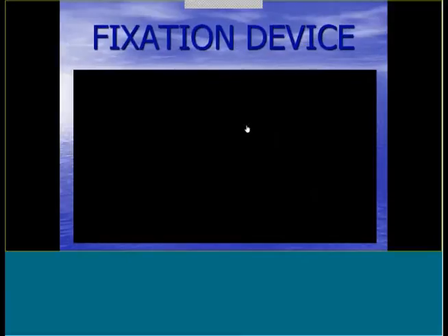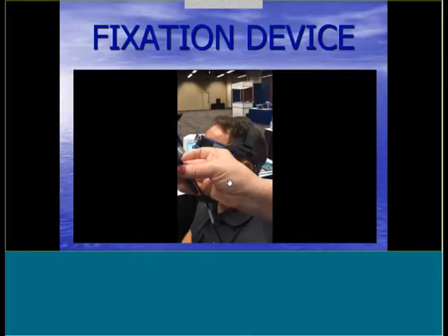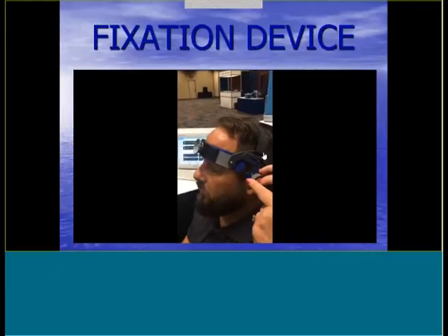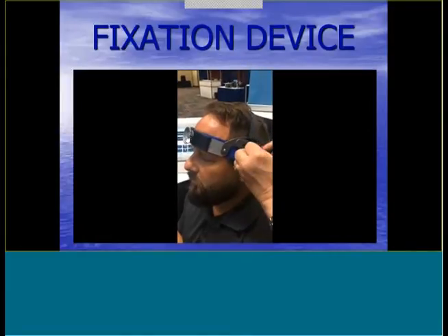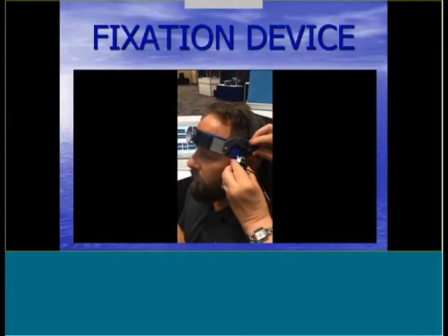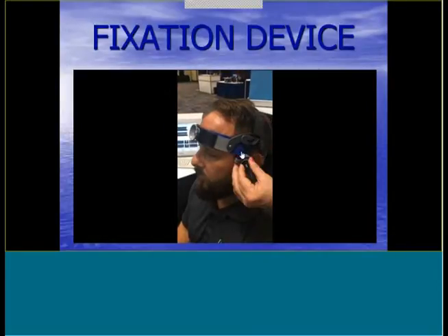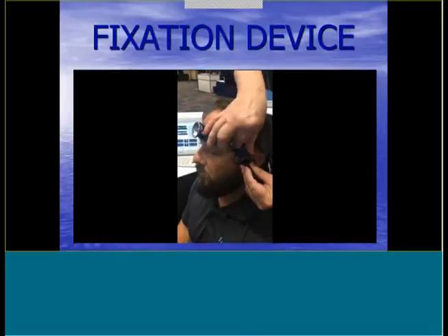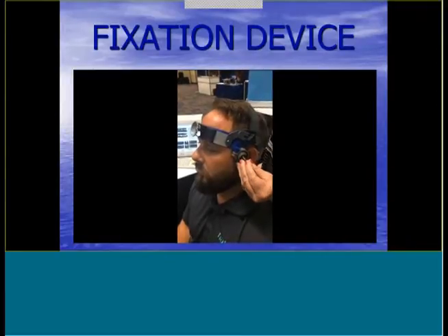So we're going to go to the next slide, and again, it's another video. Lots and lots of gel. So you can see the serrations here match up with the serrations on the little T-bar here. If you run out of gel, you can use a 10 cc syringe and squirt some in there. But you'll see here we got our knob here, and you've got a little knob here. You see that blue little knob? Knob to knob, okay? There's a left and a right to these, okay? Remember that. If this knob was the other way around, it would be in your ear and in your way, okay? So remember, knob to knob, knob to nose, okay? So you want to be lined up with the nose. This knob wants to be heading towards that knob. You see this joystick here? This is your fine tuner.